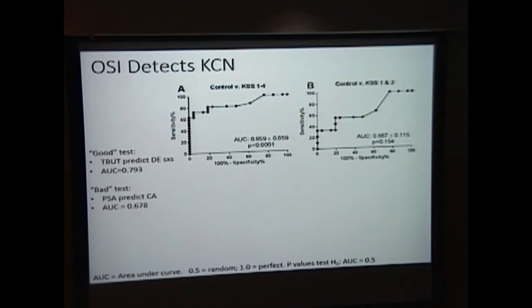So if you are doing some sort of optical system intervention, intraocular lens implant, Intacs, what have you, this would be a great way to compare interventions, because it gives you a continuous variable which you can test very readily with statistics.